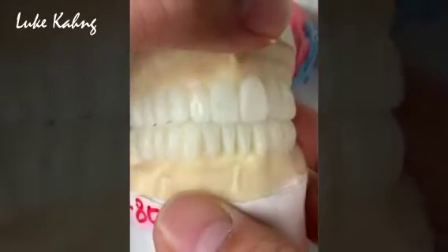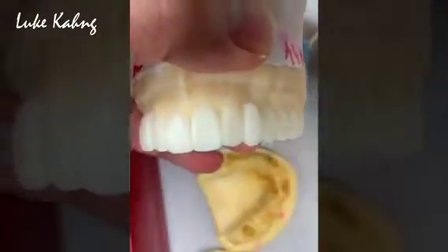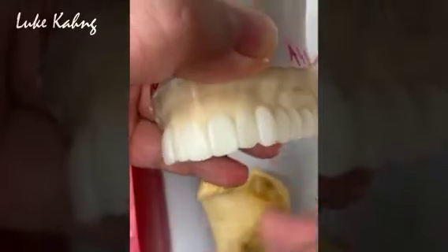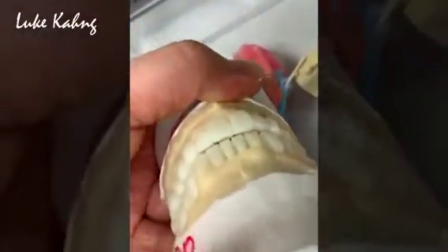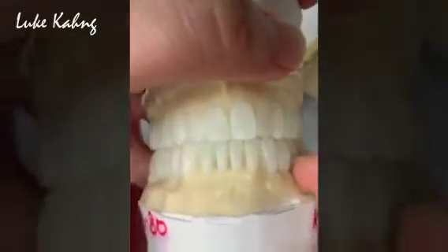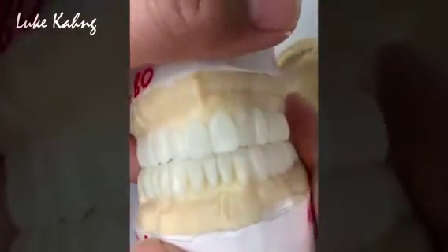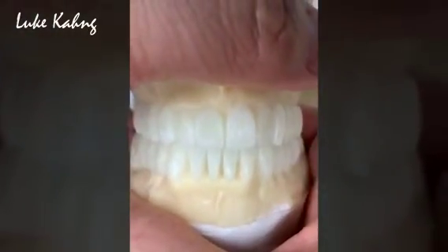For aesthetics, we make the square and round tooth types. We get the eccentric occlusion — the last step is trying to bring in the occlusion to get a favorable contour on both sides. There's a little bit less space; however, we try to increase the space and finish finalizing the trim-up and wax-up at this point.